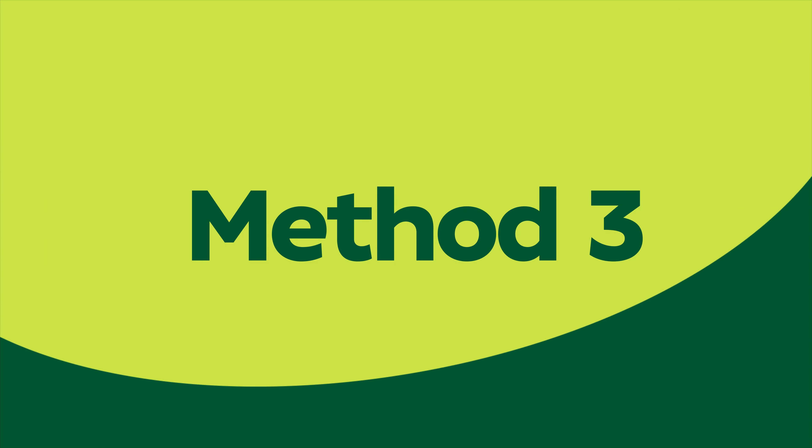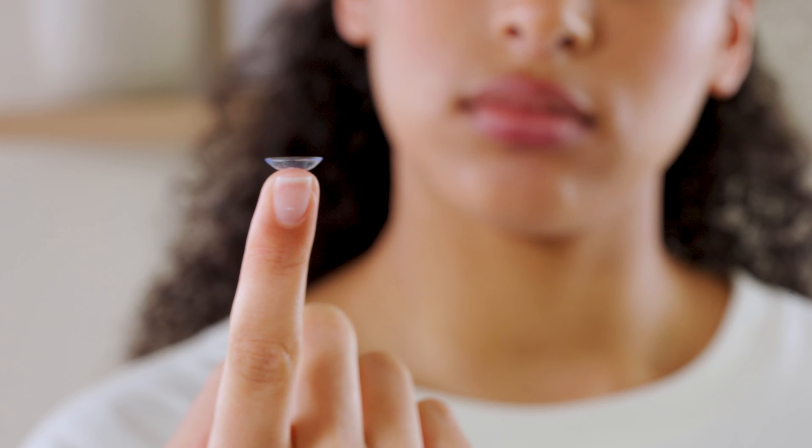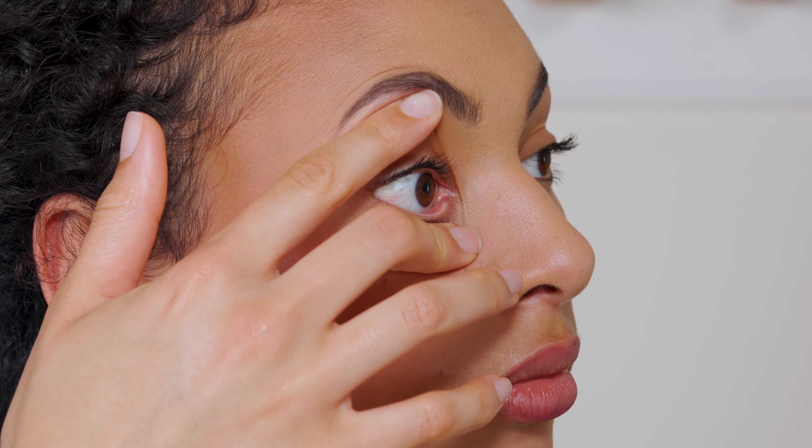Method 3. If the last method doesn't work for you, try this one. Place the lens on the index finger. Use one hand to hold open the top and bottom eyelid. Looking straight ahead, slowly bring your index finger with the lens towards the center of your eye. Whilst your eyes are still open, remove your finger. If you close them too quickly, the lens may fall out. If it does, that's okay — just start again. Move them from side to side and up and down to get rid of any air bubbles. Then blink a few times to let the lens settle, and you're ready to go.